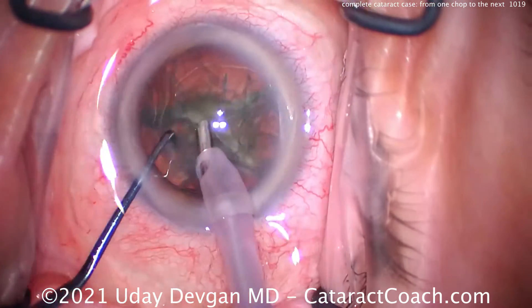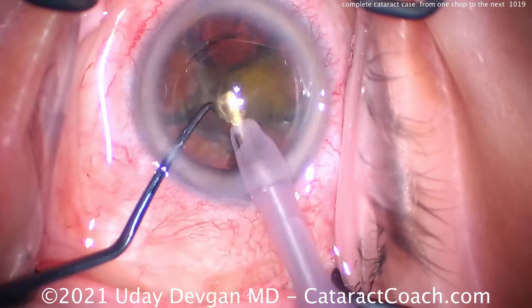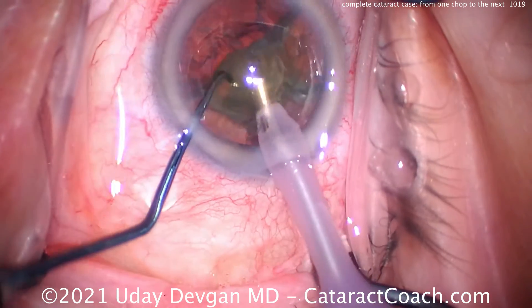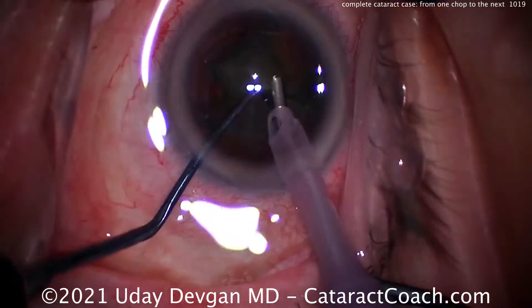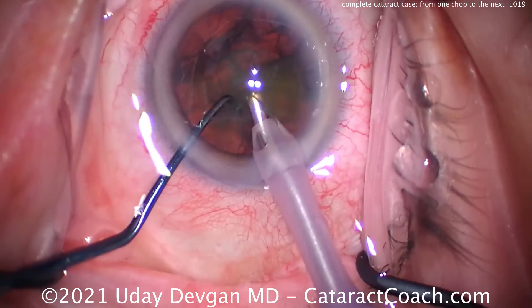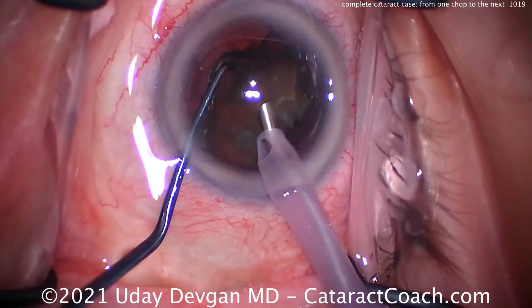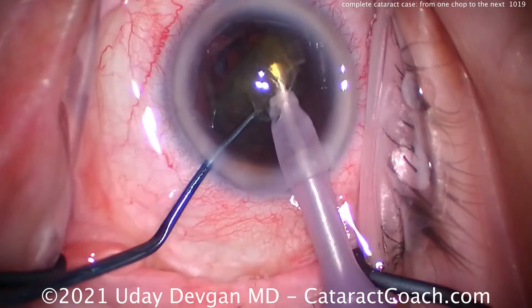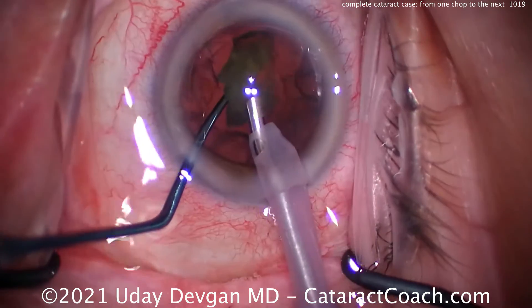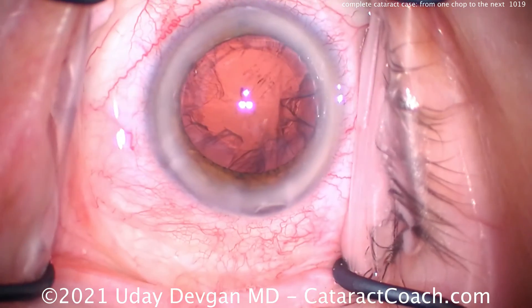We can even rotate to the other half, rotate some more, buzz with the chopper and probe, put the chopper on the equator — boom. Now we've got about four or five pieces of nucleus, easy enough to remove them all. Just emulsify, stay there in the center — the pieces will all come to you. Notice how when I grab a piece, I bring it centrally, staying a little bit away from the capsule bag. Now we're getting some wild reflections here because this patient has lost a lot of orbital fat — this is Beverly Hills. She's had a blepharoplasty where they took out too much fat, and as a result we've got a lot of pooling of the balanced salt solution on the surface. Her eyes are a little more sunken in after that cosmetic surgery, which is why we're getting reflections back at the camera on its automatic brightness setting.